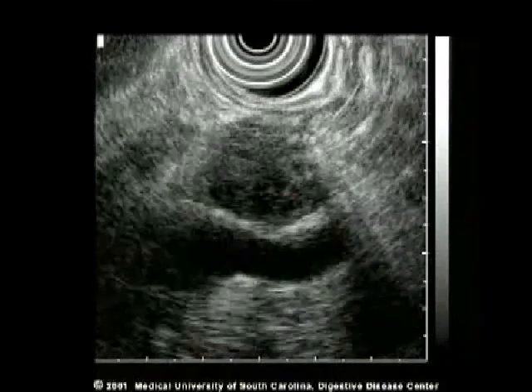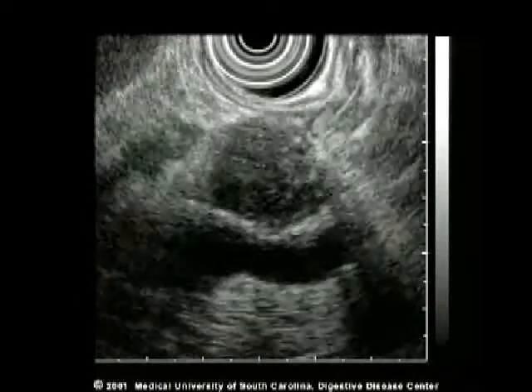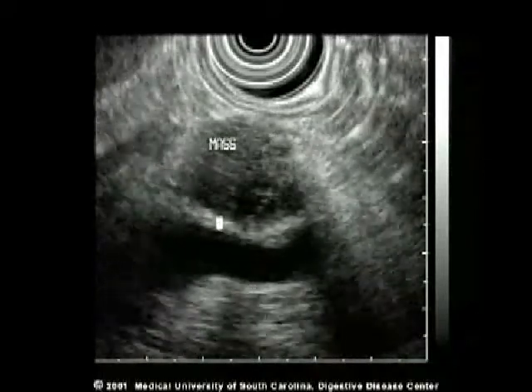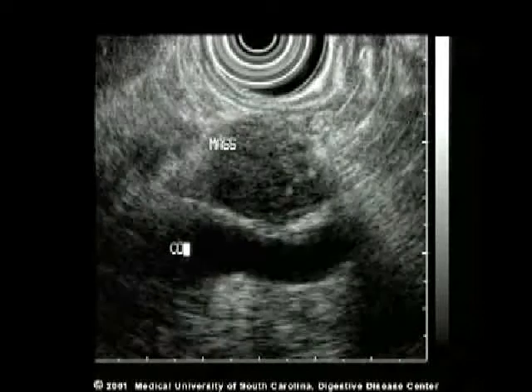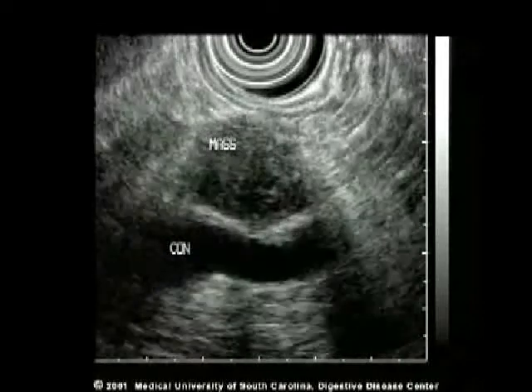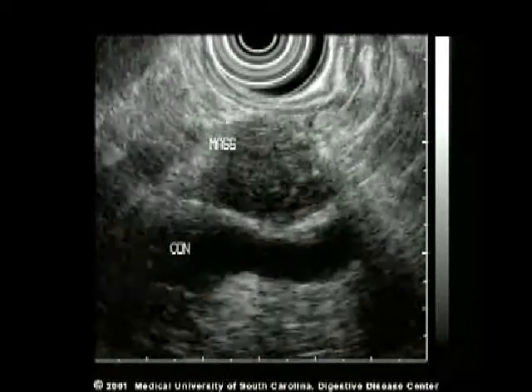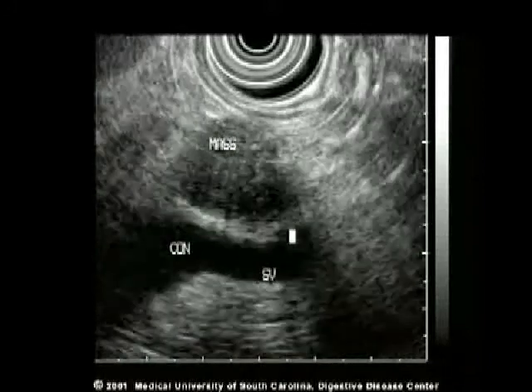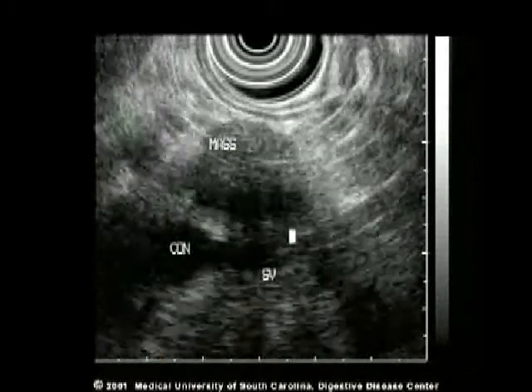This video demonstrates a T3N0 cancer of the pancreas. In this case, a large mass is seen in the head of the pancreas. The portal confluence and splenic vein are shown immediately below the mass as viewed from the stomach wall. The transducer is located in the mid portion of the body of the stomach.